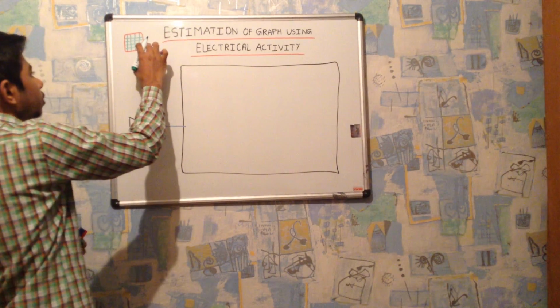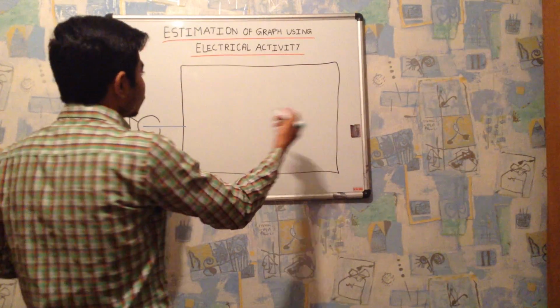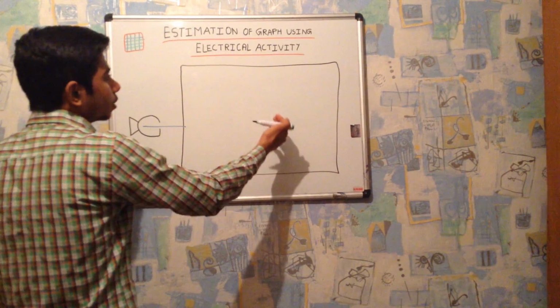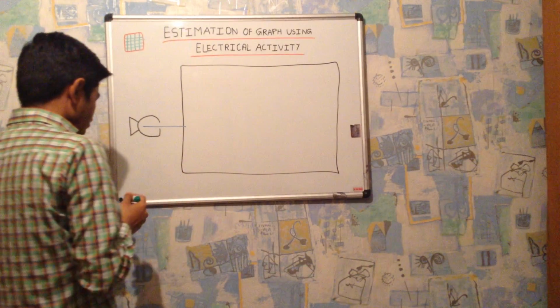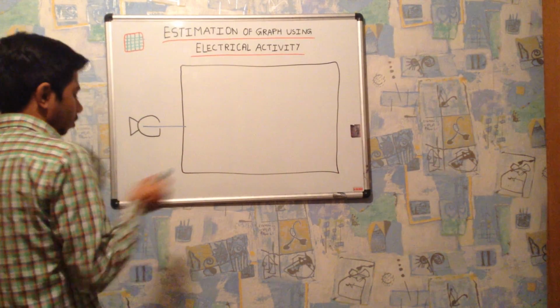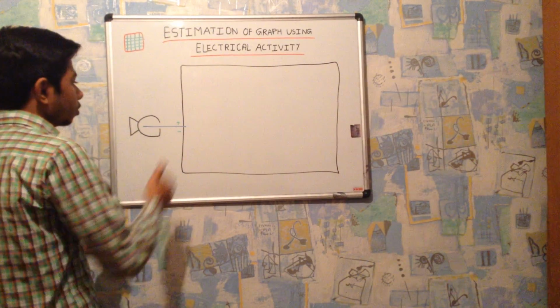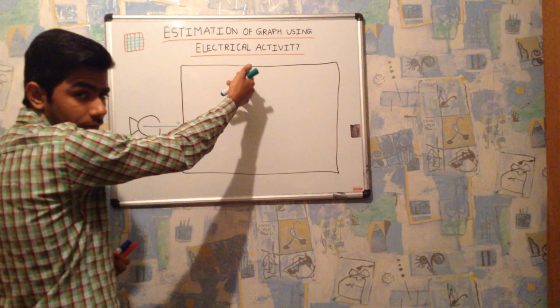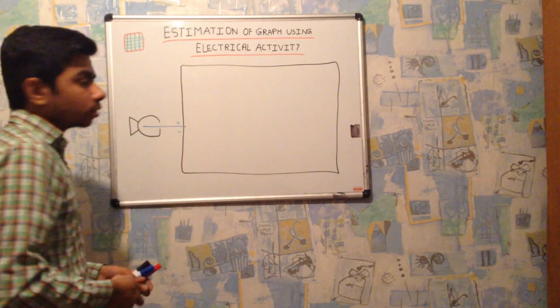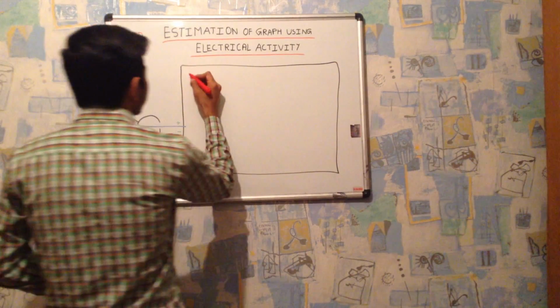So these type of 300 big squares will pass through this needle at the speed of 300 big squares per minute. So, here we have positive, we have negative. This needle will fluctuate according to the electrical event occurring inside our heart. So let's recall our first electrical event.